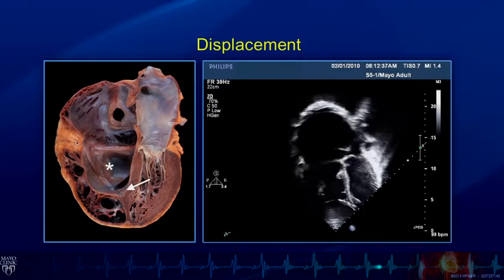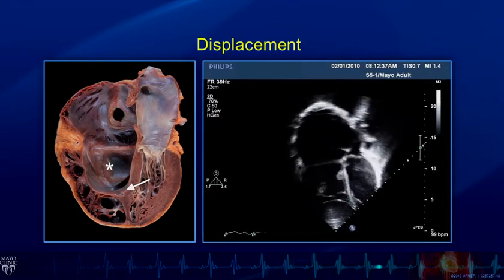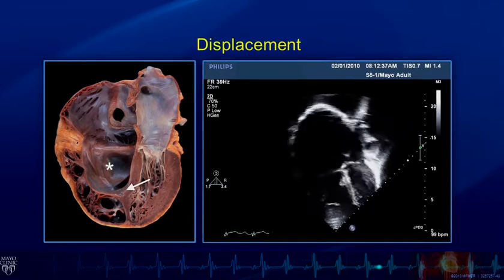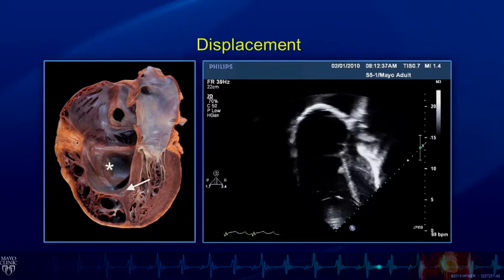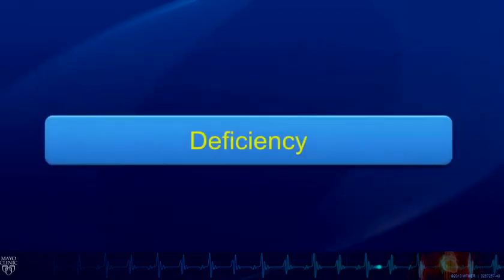Very small left heart chambers that are on the right side of the screen, and then the right heart chambers on the left side of the screen, very large, extremely large. There's apical displacement of the septal leaflet, elongation and tethering of the anterior leaflet, and there was associated severe tricuspid valve regurgitation. And again, you'll see additional images later in this series.